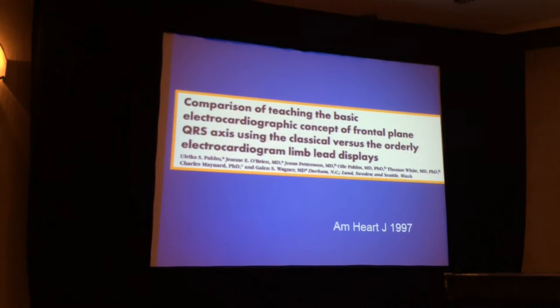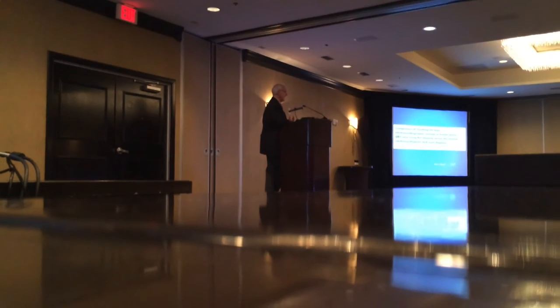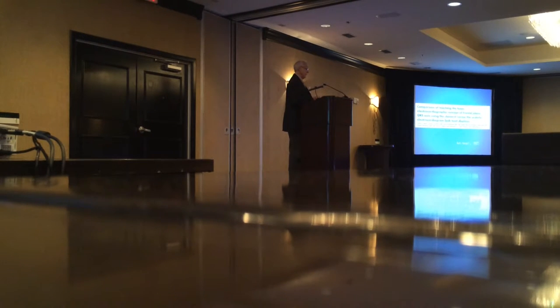And so she designed a study with undergraduates who had never seen an ECG before, but who were randomized to be taught looking at either the orderly or the traditional standard sequence. She actually did the study and presented it at an ISCE meeting up the coast here a bit in Amelia Island, in whatever year historians can tell us the Amelia Island meeting occurred. But she found in this study that there were two advantages. One was the students could then, in testing, calculate the frontal plane axis more rapidly, and two, more accurately. So there was an advantage in teaching using the orderly sequence as the display versus the classical.